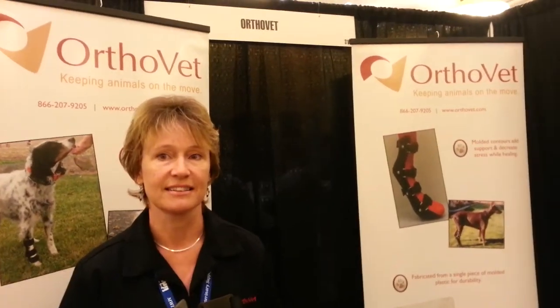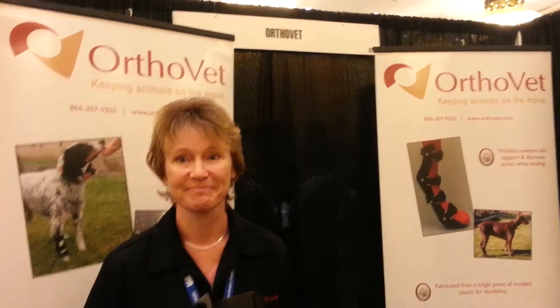Hi, we're at MWI sales meeting talking to Coral Ann about the OrthoVet standard splints.